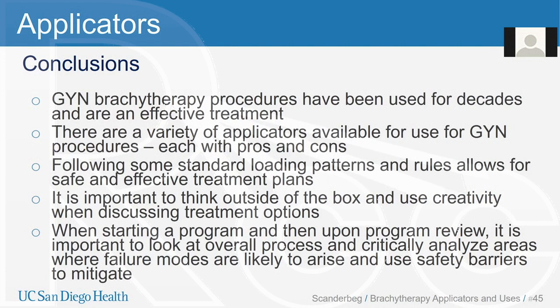Follow some standard loading patterns and rules. It allows for safe and effective treatment plans. Again, consistency is very important. If you don't follow consistent plans, it's another way of introducing possibility for error.